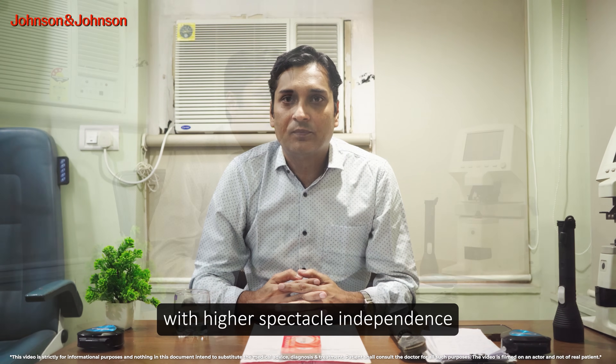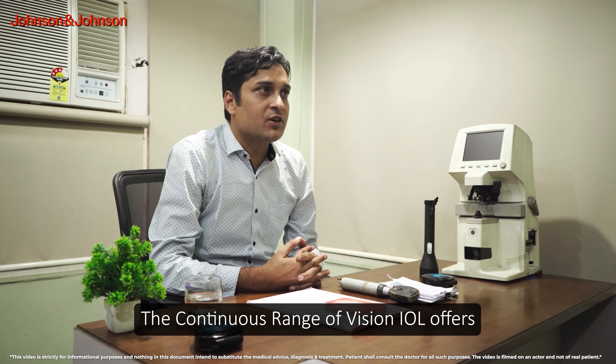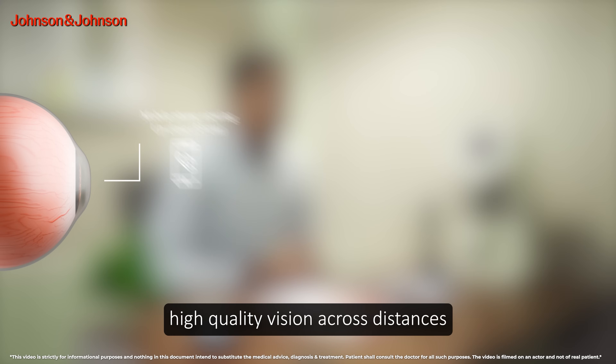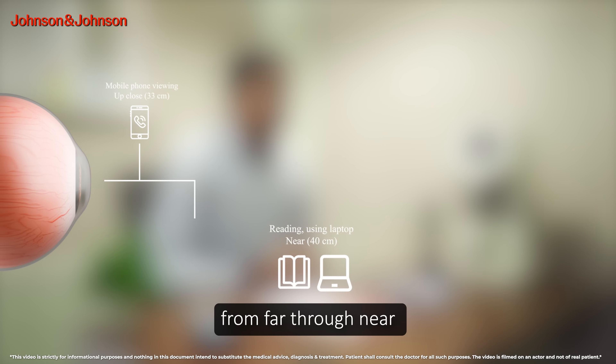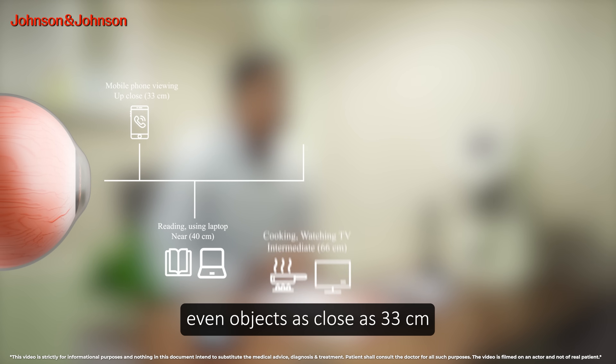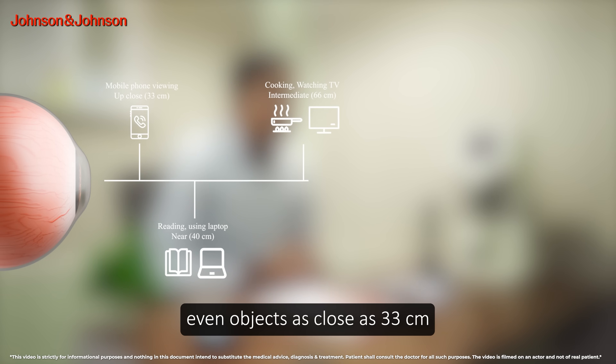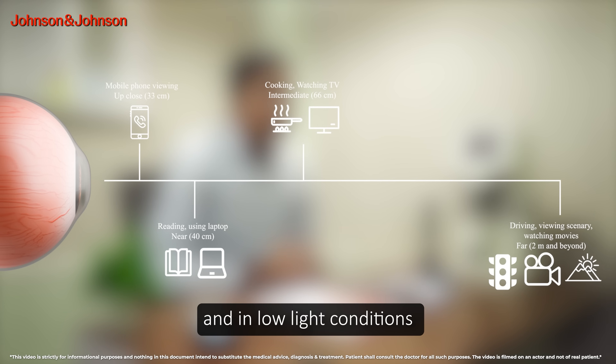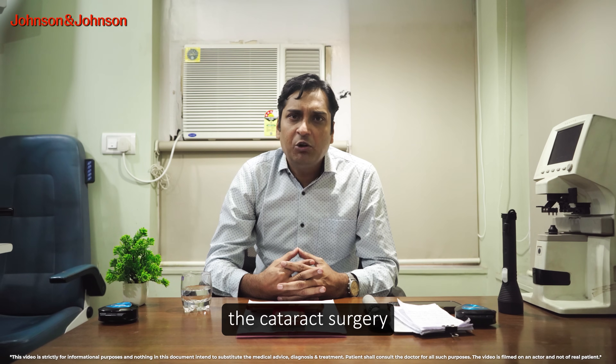The continuous range of vision IOL provides high-quality vision across distances from far through near — even objects as close as 33 centimeters — and in low-light conditions. For people who have astigmatism, cataract surgery is also an opportunity to get it corrected through Toric IOLs.